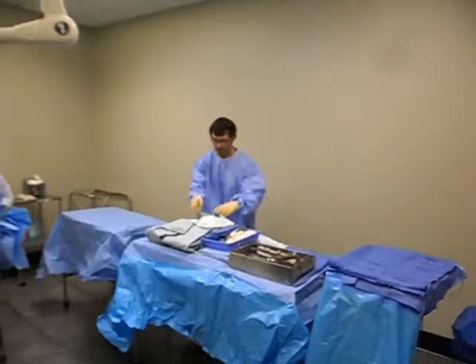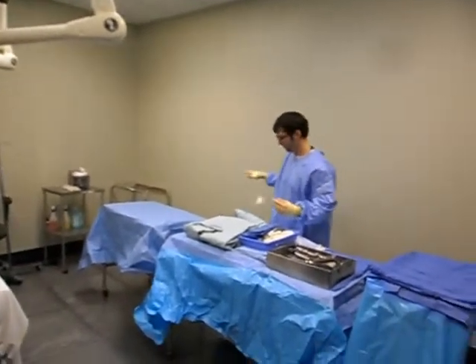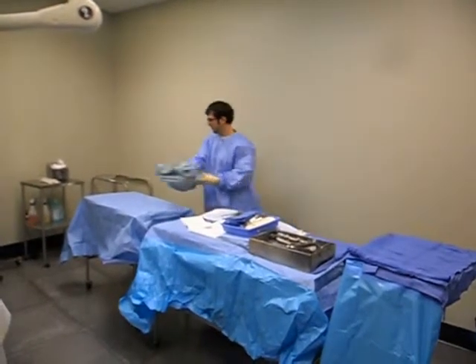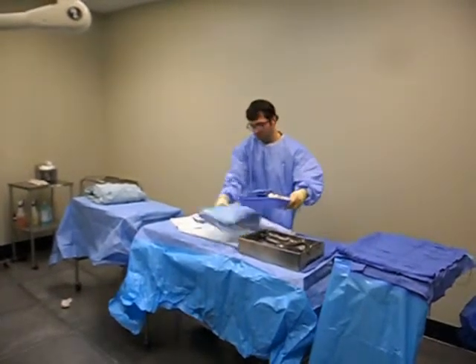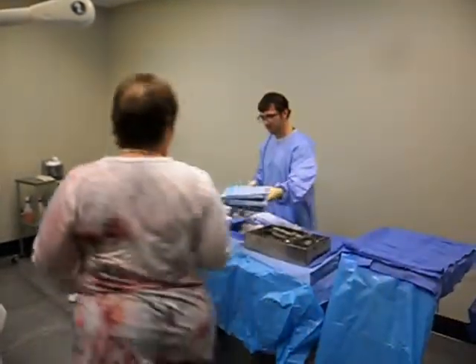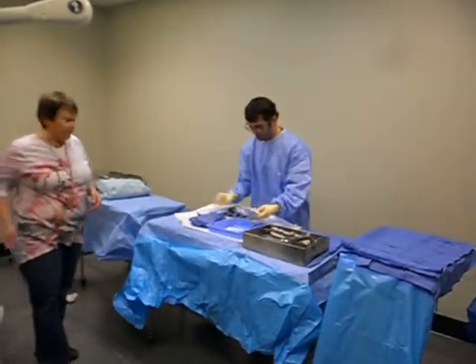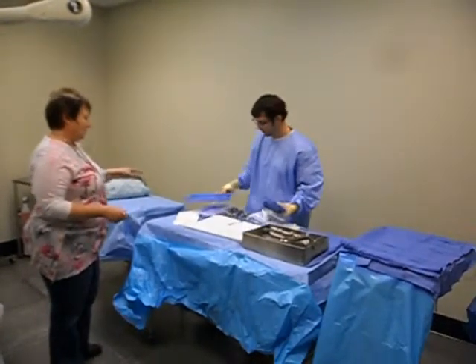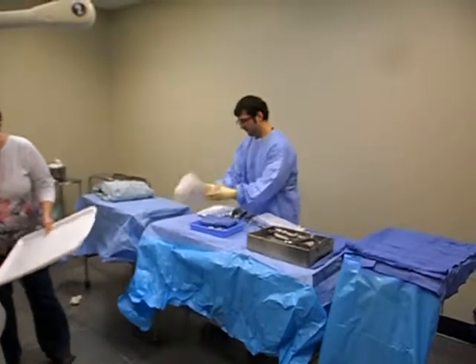Nice. Okay. I got another one. So is this one an extremity drape? Don't give me the stuff you don't need on that pack. Okay, extremity drape, don't need that. I do need that one, however, I don't need this. These towels are always good to keep. Duodenum or pancreas, might put something in there. Good idea. Don't want this one, though. This is a towel.